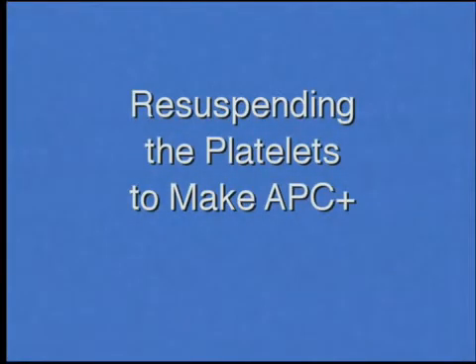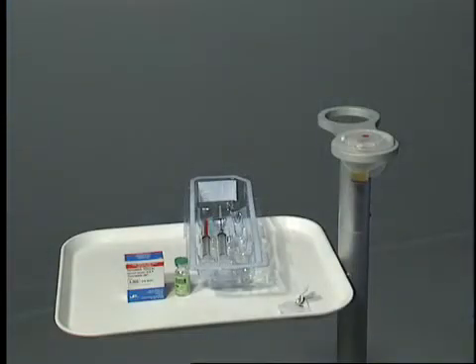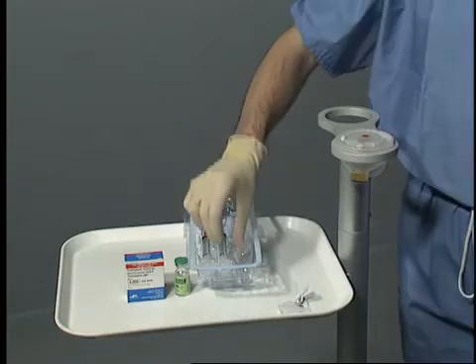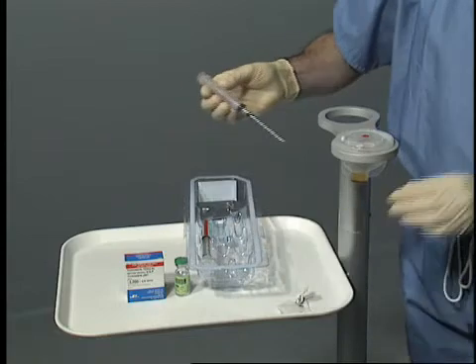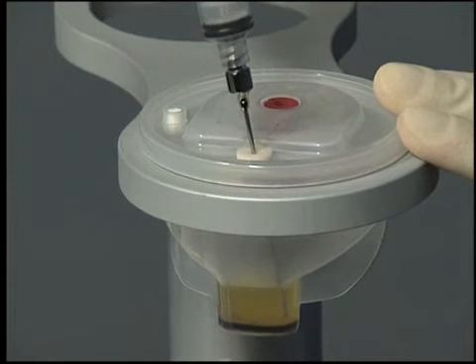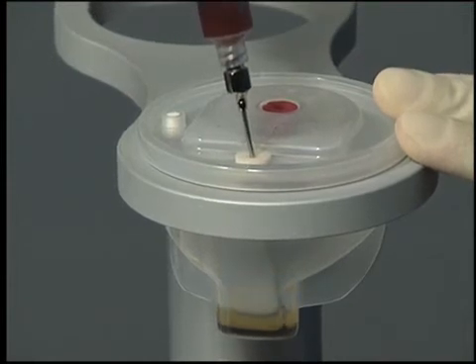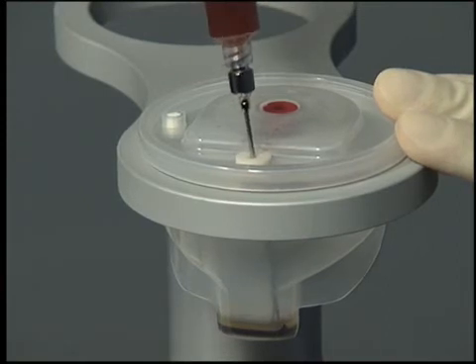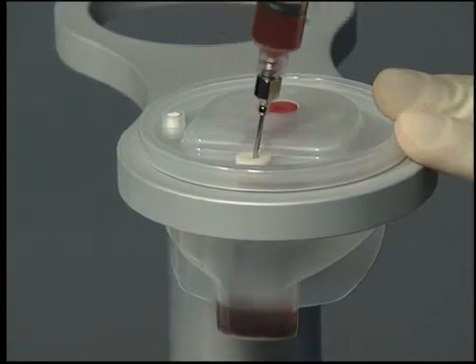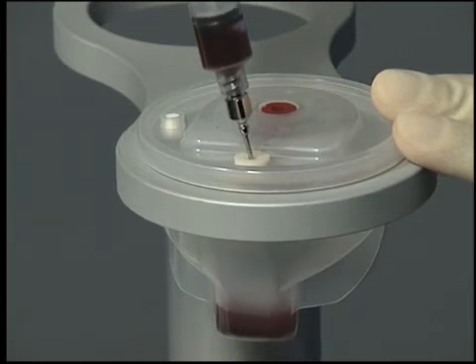Resuspending the platelets to make APC plus: the platelet concentrate is resuspended in the remaining platelet-poor plasma, thereby creating a very concentrated autologous platelet concentrate enriched with growth factors, or APC plus. Resuspend the platelets by withdrawing the remaining platelet-poor plasma into the platelet concentrate syringe without the spacer, and gently injecting the platelet-poor plasma back into the plasma chamber. Repeat this process two to three times until the platelets have been visibly resuspended.